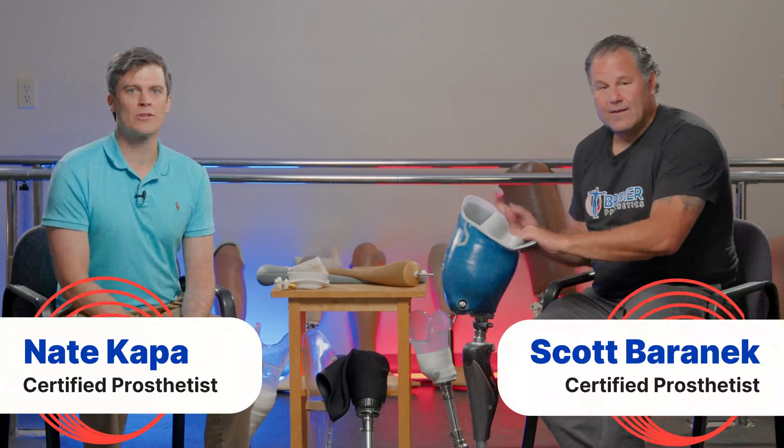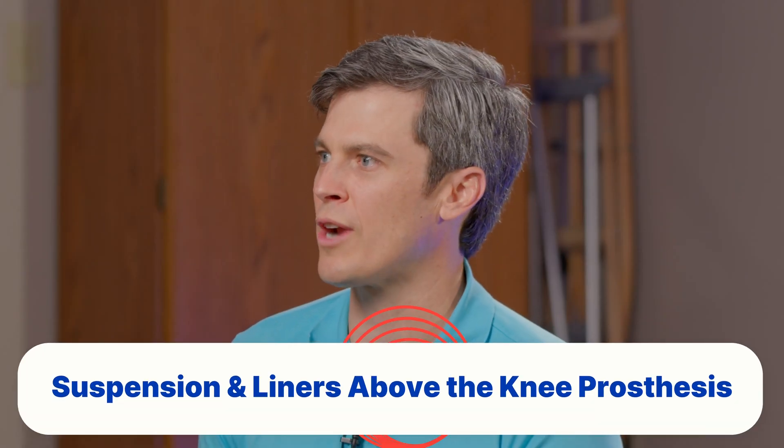Hi, I'm Nate Kapa from Bremmer Prosthetics and I'm a certified prosthetist. And I'm Scott Baronek with Bremmer Prosthetics and I am a certified prosthetist. Today we're going to talk about transfemoral suspension.